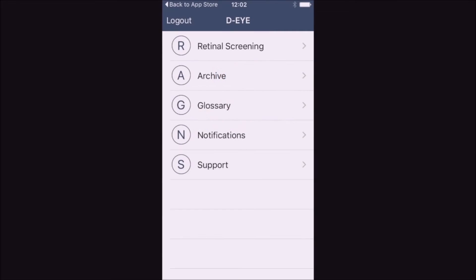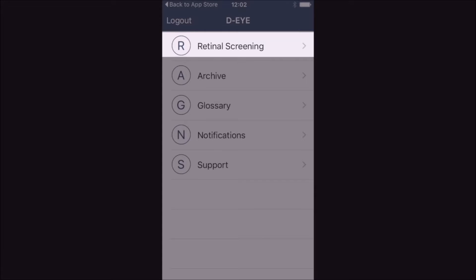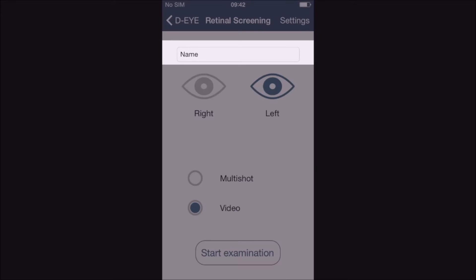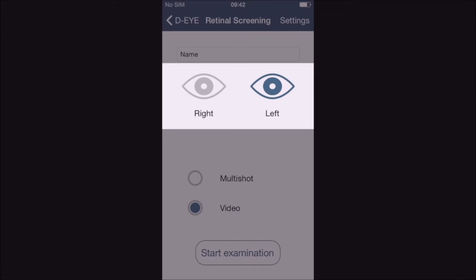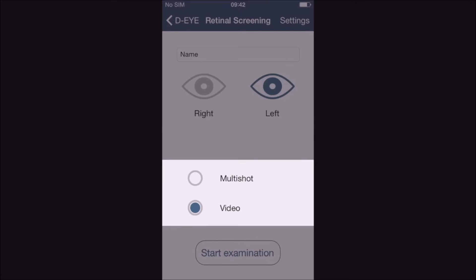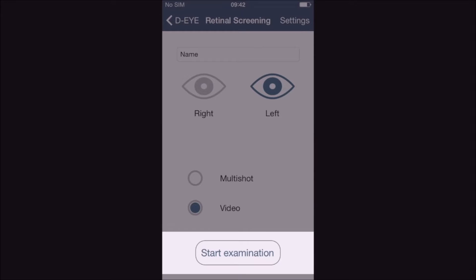Click on Retinal Screening. Write in the patient's name. Choose right or left eye. Choose Video. Click Start Examination. It's that easy.